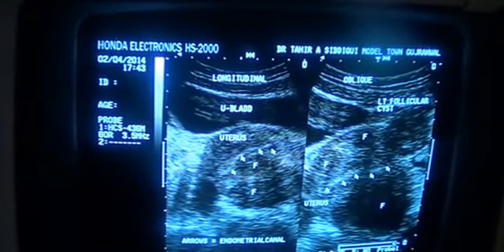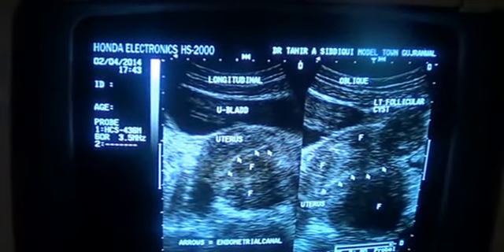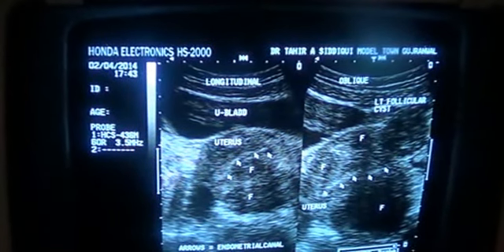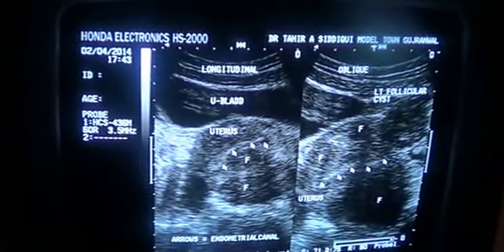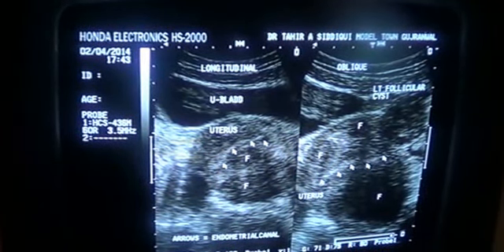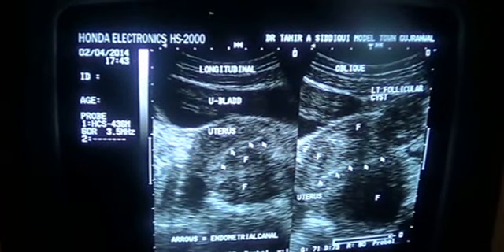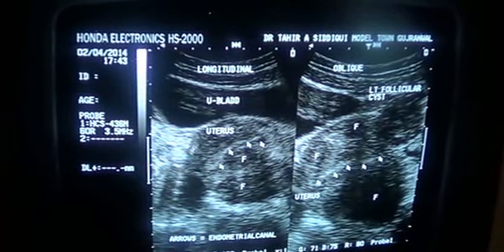Well, this is a pelvic ultrasound of a 20-year-old woman, married 1 year, no issues, who came to rule out any pelvic pathology as she wished to conceive and is not conceiving so far. So what's seen on the ultrasound now is the uterus.